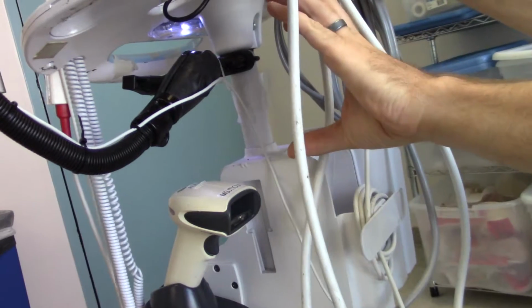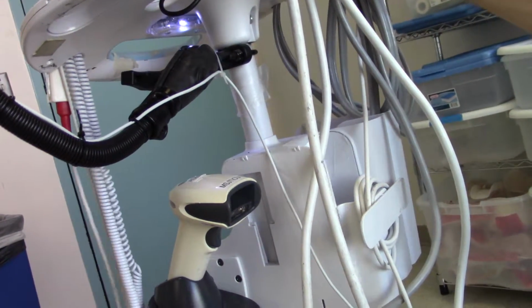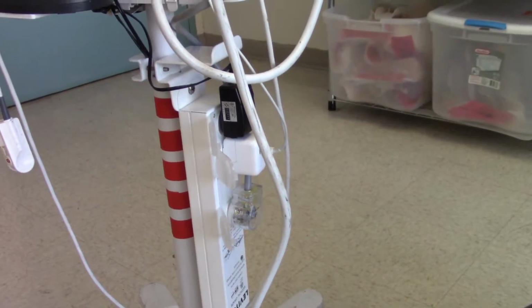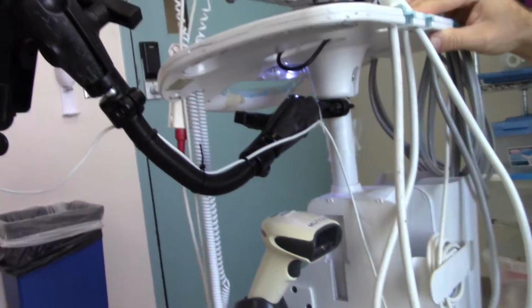You have a little power strip in the box here. One little power cable comes down to here. That's an actual robust something like this, or a right angle plug. That would be what I would say is the ideal. I'm not an engineer, so. No, but we're very interested in your thoughts.